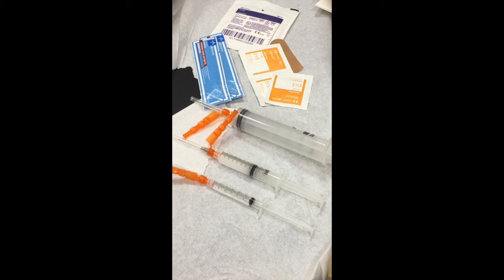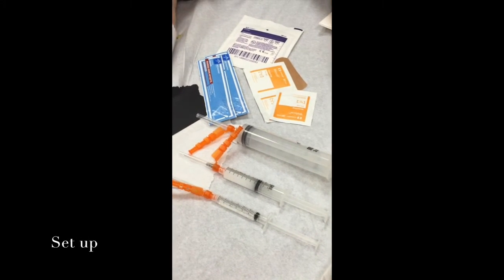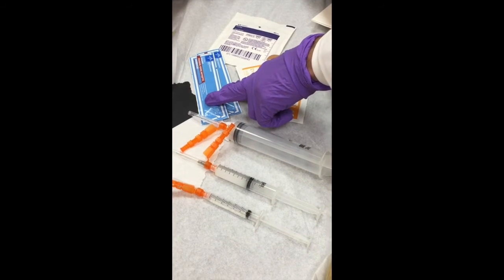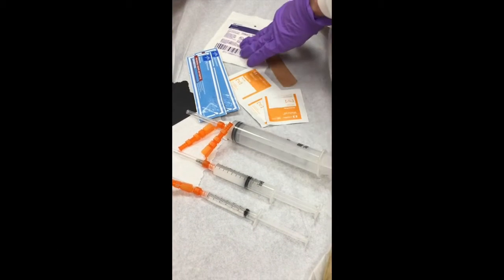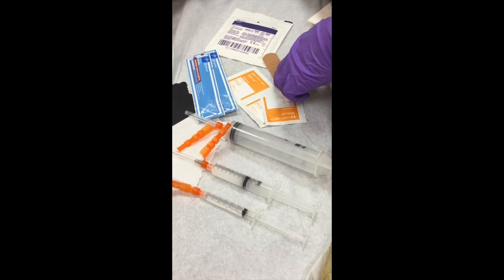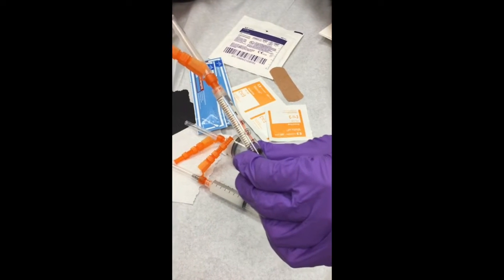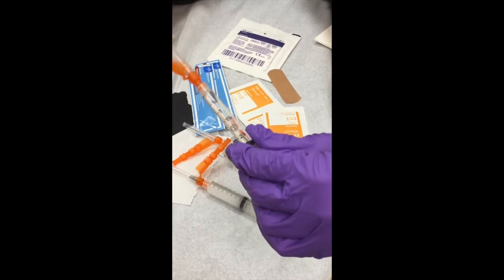We're going to perform a standard knee aspiration cortisone injection. We have all our items set up on a table: two sticks of standard betadine, a couple of alcohol pads, gauze to wipe off, and a band-aid. We've drawn up a few cc's of 1% lidocaine as a superficial local anesthetic on a 25 gauge needle.